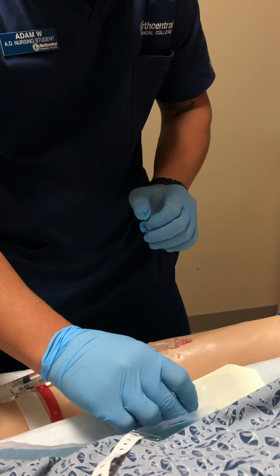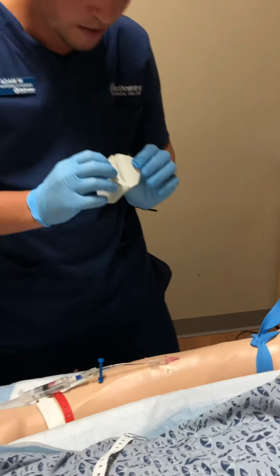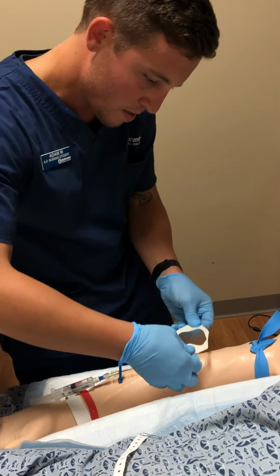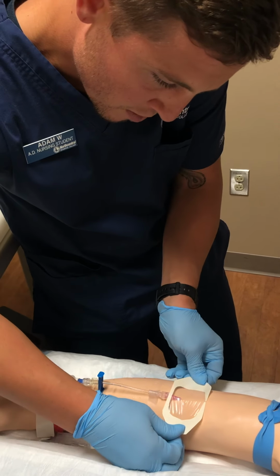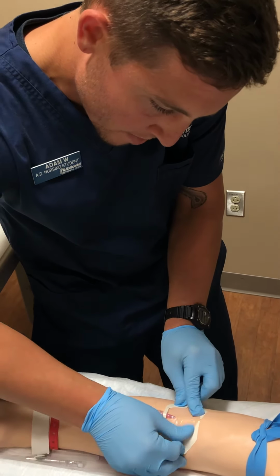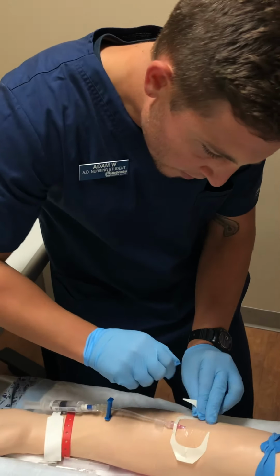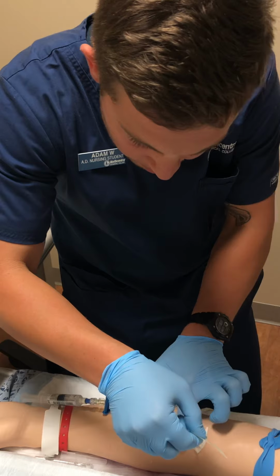What we can do next is we'll put on our transparent dressing. Okay, you're doing very good, Mary. We're almost done. So it's going on top, and it's gonna go right here. Okay, make sure it's on there nice. And then we have this outer coating here, and that's gonna come off like so. Make sure it's all pressed down.